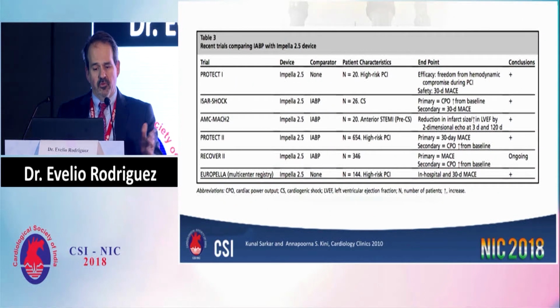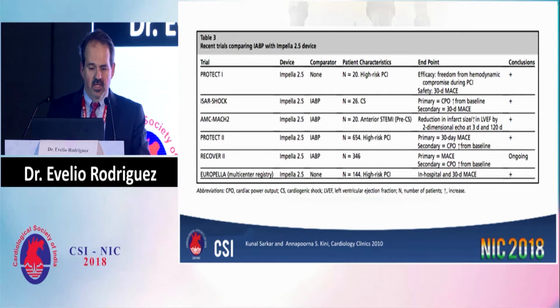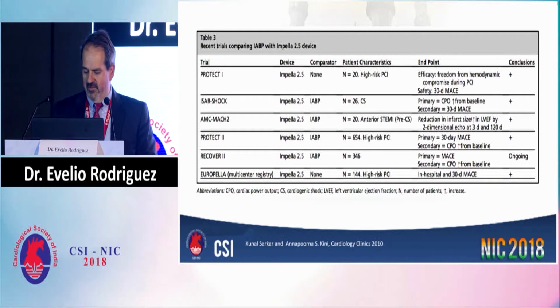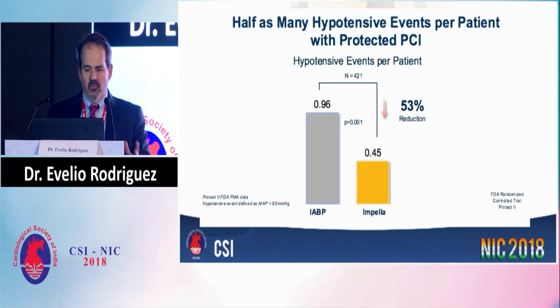There have been multiple studies looking at the benefits of Impella, and these are some of the studies: Protect 1, the ISAR-SHOCK, and then the more recent ones, Protect 2 and Recover. But basically, when you combine those studies, and that was a combination of either comparing to something which usually was the intra-aortic balloon or no other support, the summary is as follows.